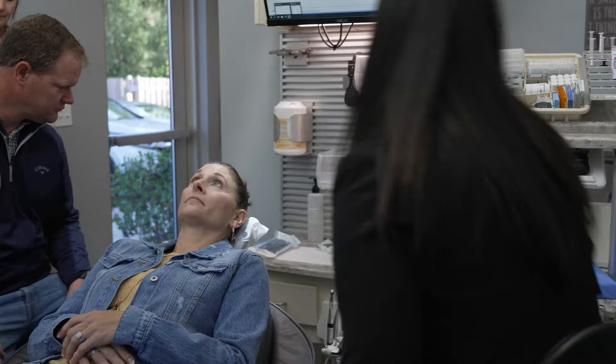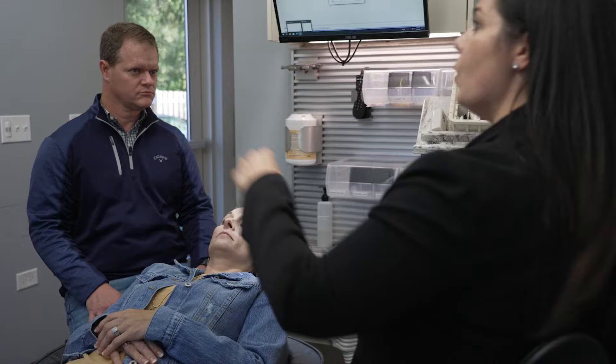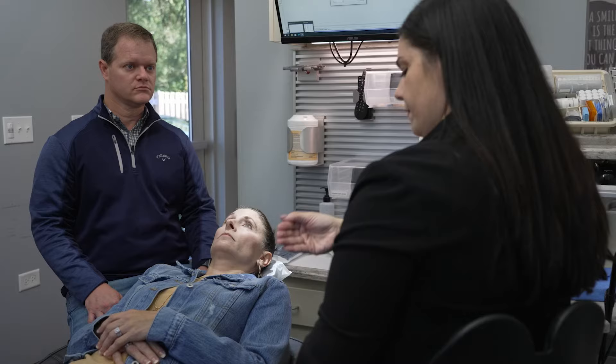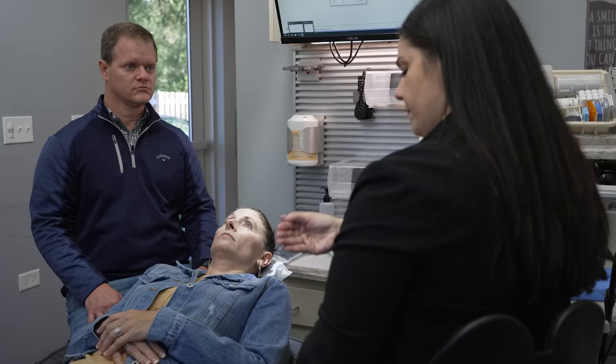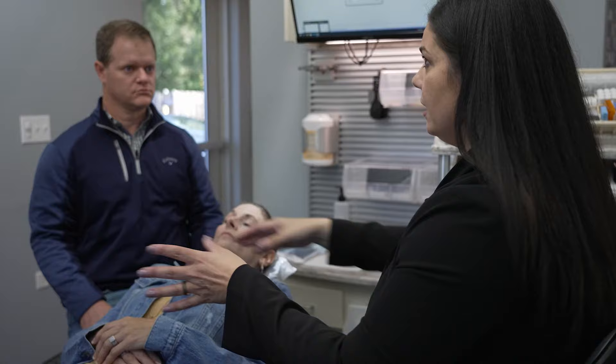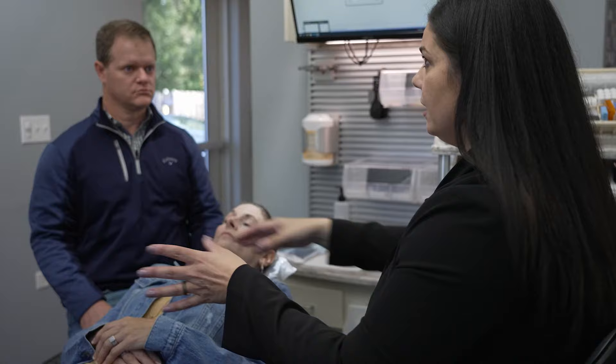It is. So this will articulate. We want four feet. Those lights should not be shining in her eye — those are designed to illuminate the work surface. The reason why it's off is because somebody pushed this chair and got it out of my sweet spot. Dr. Potts, do you remember how much space you need? You knew the why — that's the most important. You need four feet from center of the headrest to that back wall, the drywall. That way the doctor is free to circulate from 7 o'clock to 12 o'clock.